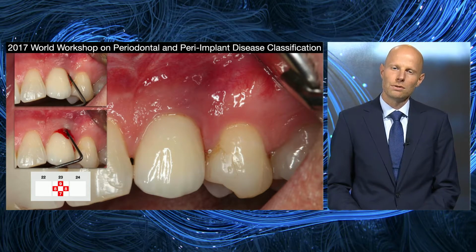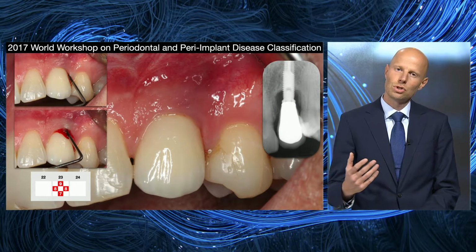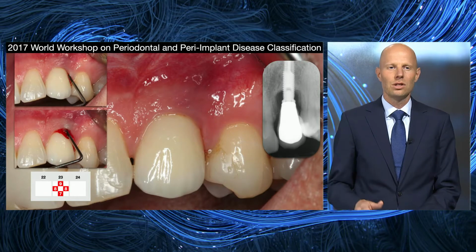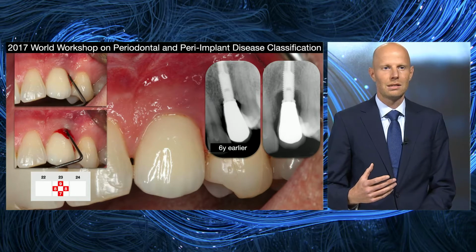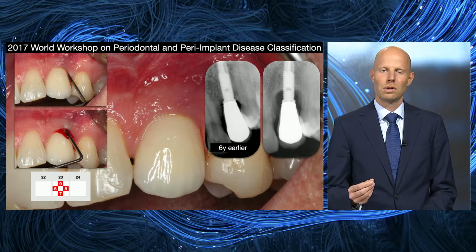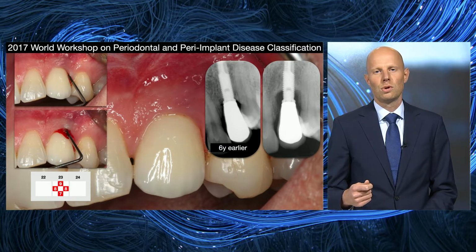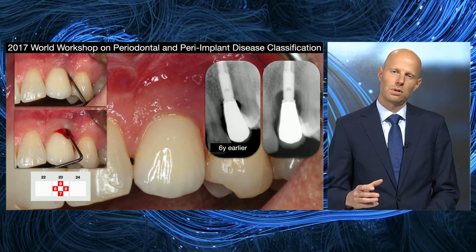The radiograph is added and is of course also required, but it is secondary and only supports these primary findings. It's not so much the one-time radiograph as you see here. It is rather the change over time, capturing, as in this case, the progressive bone loss that we connect with peri-implantitis. Taken together with the clinical findings of bleeding and an increased probing pocket depth, we then come to a proper diagnosis of peri-implantitis.